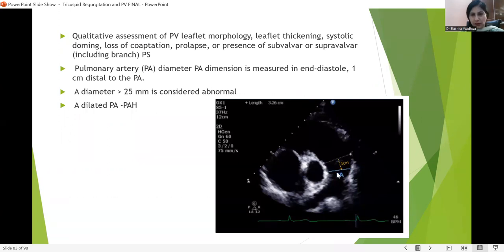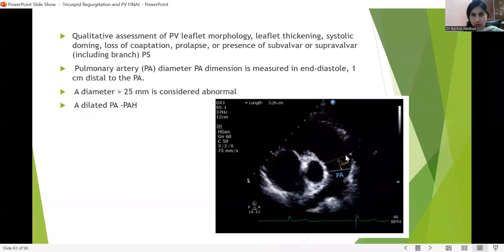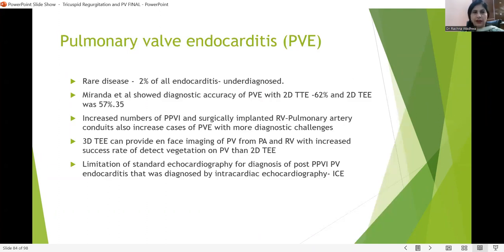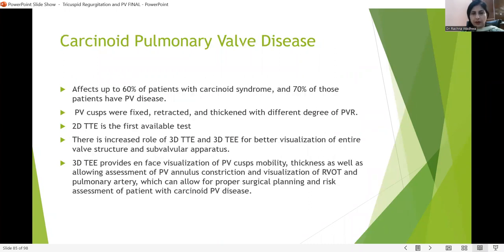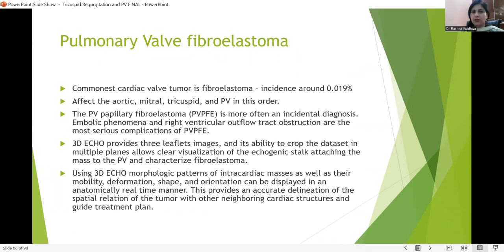Measurement of PA diameter is very important and is generally done in end-diastole — the average diameter is around 1 to 2 cm. If it is more than 2 cm, there is severe PA dilatation, which may be secondary to pulmonary hypertension. Pulmonary valve endocarditis, though very rare, may be found occasionally and is a diagnostic challenge. Carcinoid valve disease may affect the pulmonary valve similarly to how it affects the tricuspid valve. The cardiac valve tumor fibroelastoma can affect all valves — aortic, mitral, tricuspid, and pulmonary — and 3D echo is the best modality to delineate it.